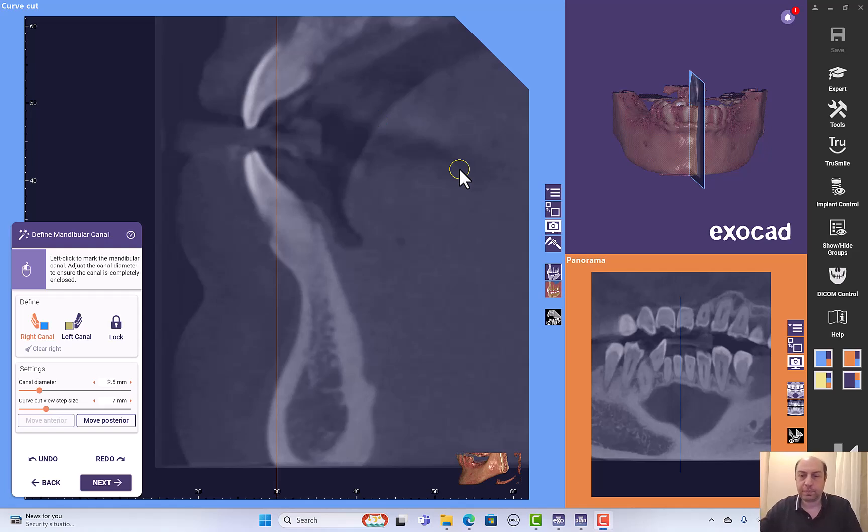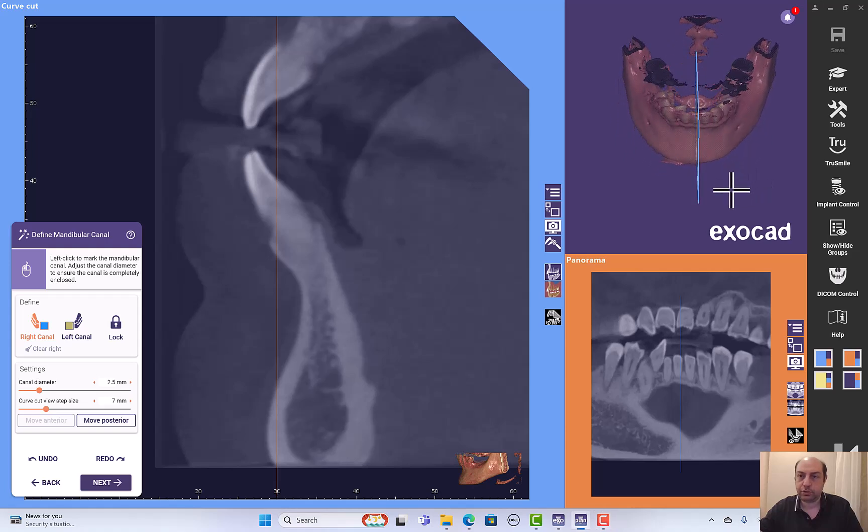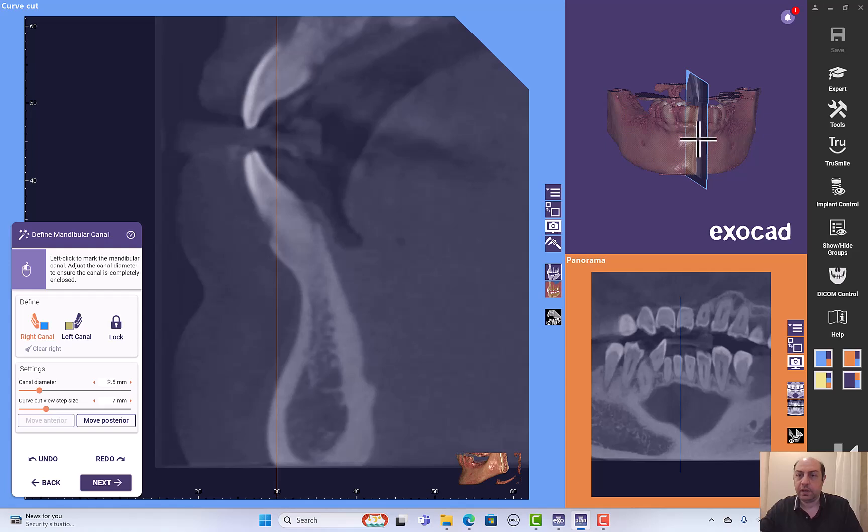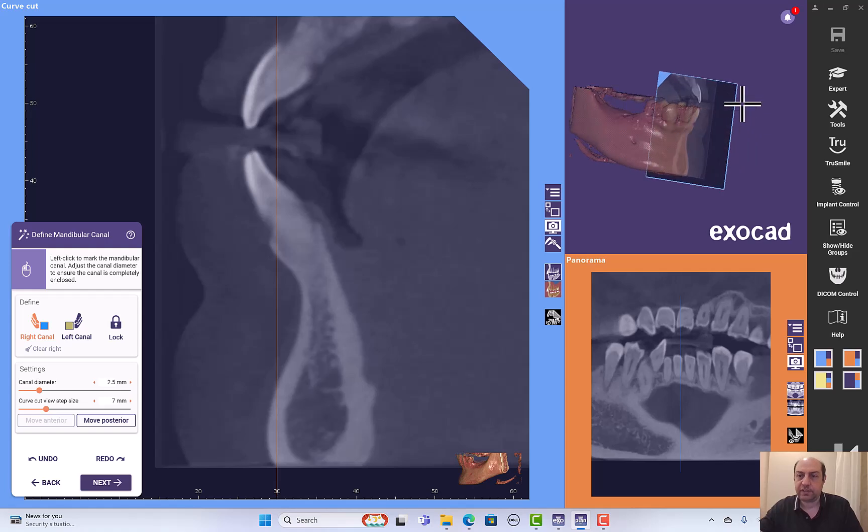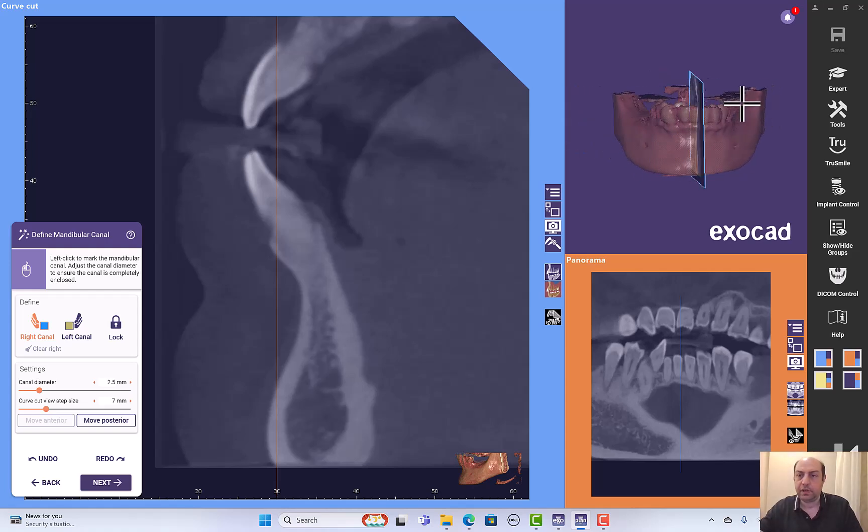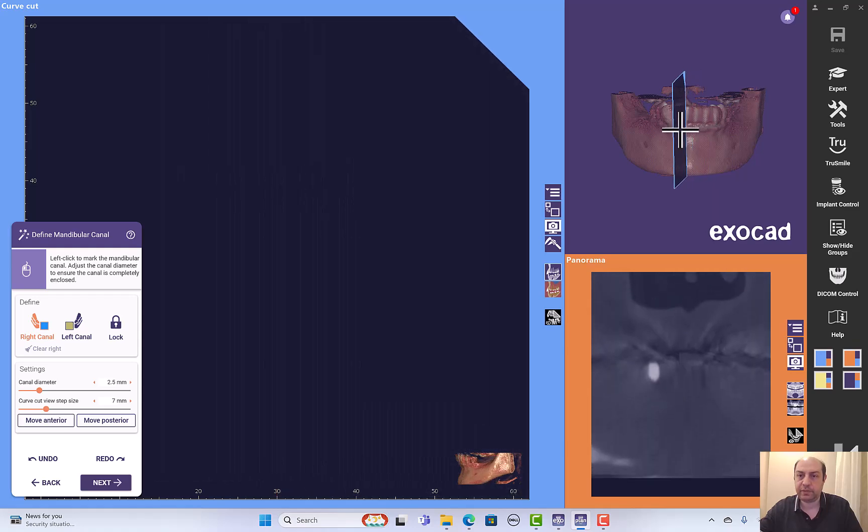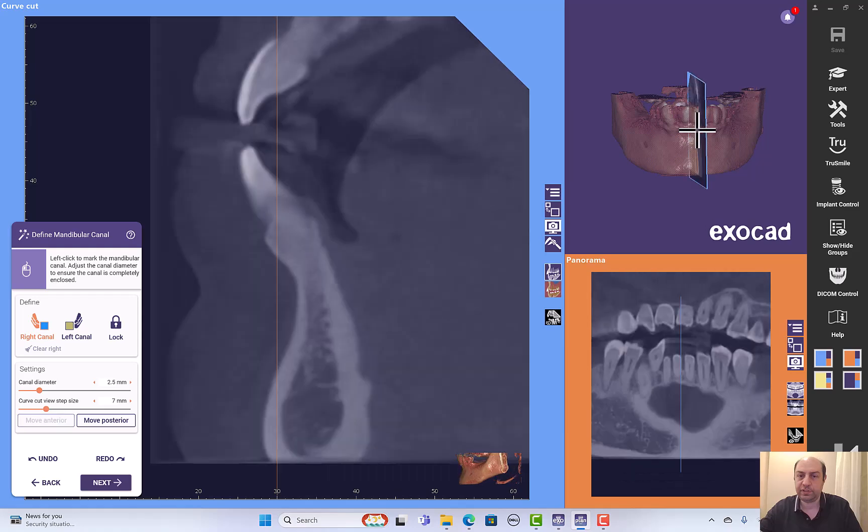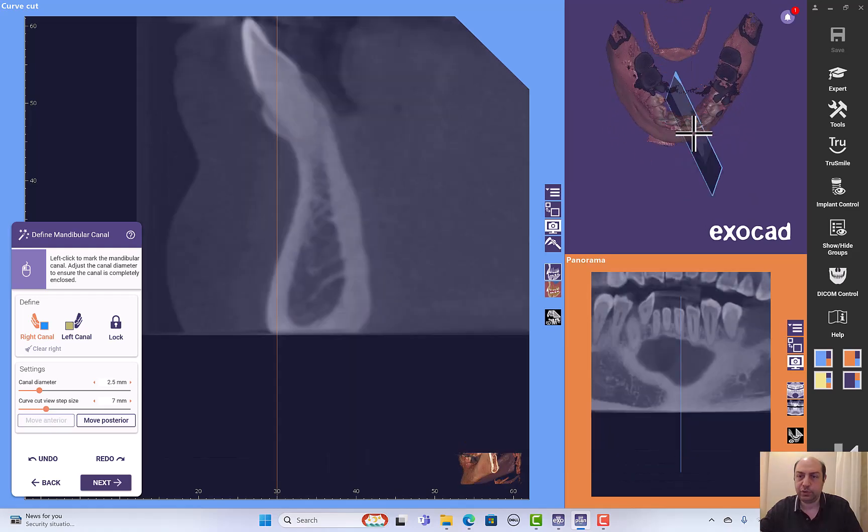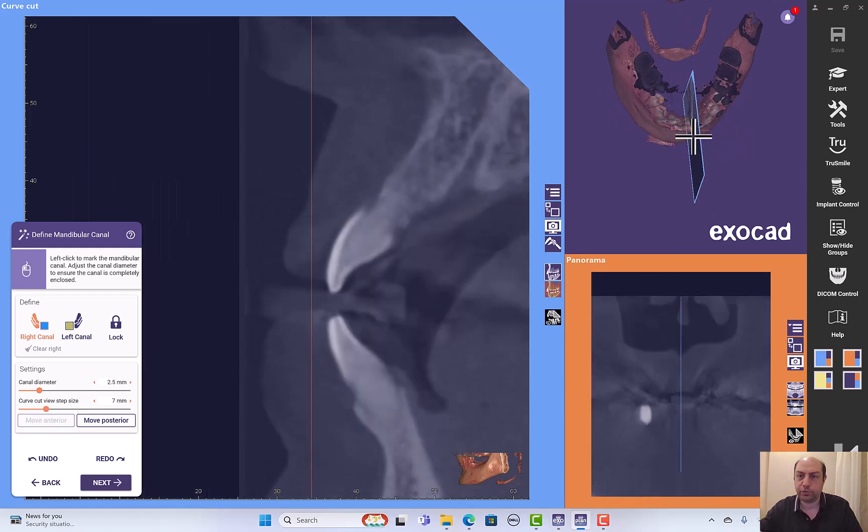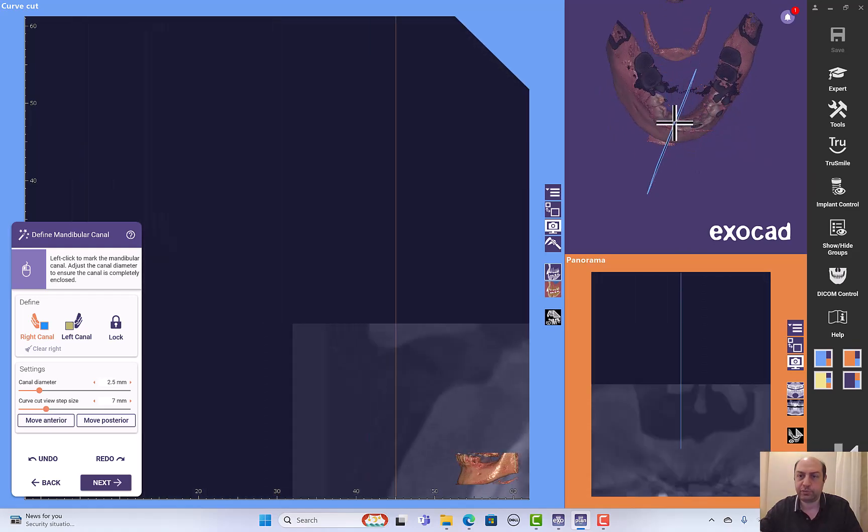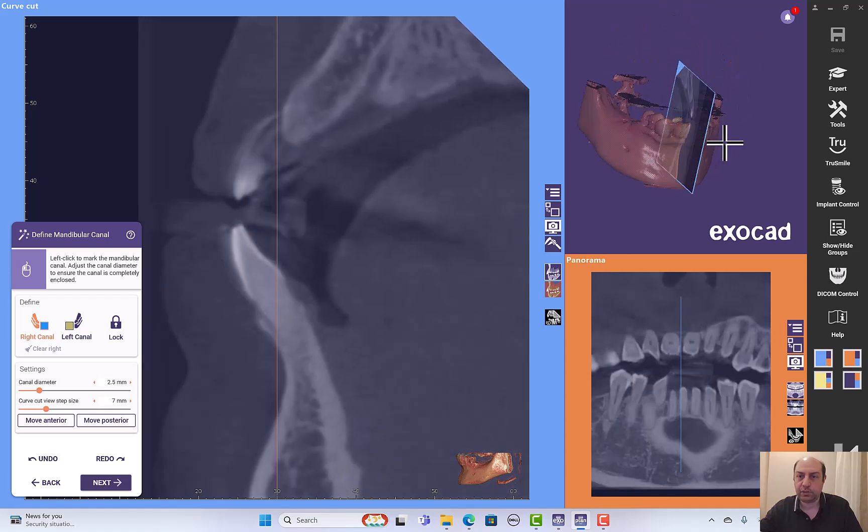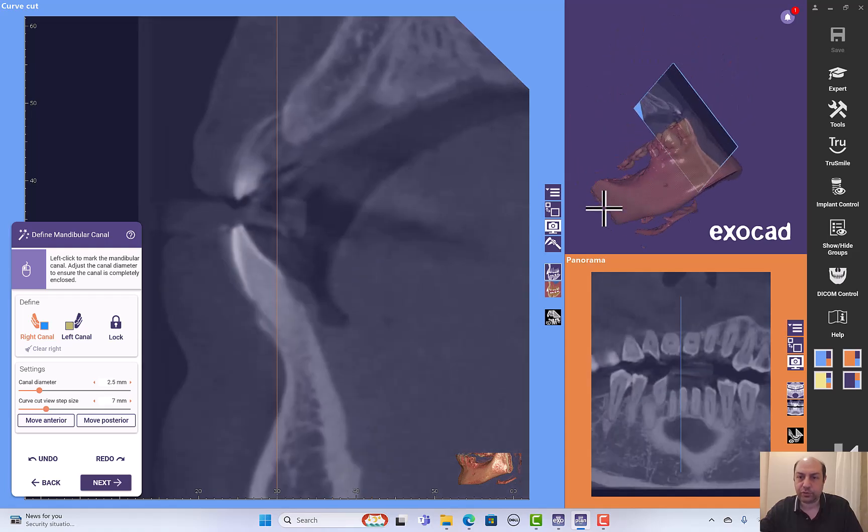Our next step is a very important step for posterior teeth, which is nerve tracing. Let's get to know the icons and how to deal with them. Here you have this cut on the 3D. You can just click and keep pressing the wheel of the mouse and you can move it in different areas, put it forward or backwards, move it to the sides, or better to go to the part that you want.